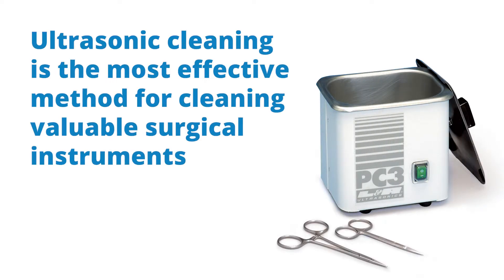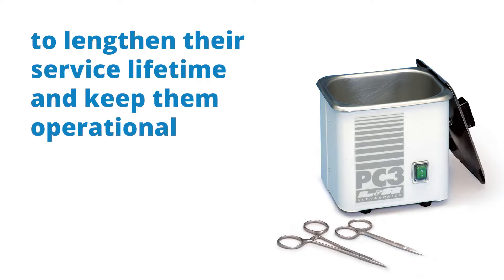Ultrasonic cleaning is the most effective method for cleaning valuable surgical instruments to lengthen their service lifetime and to keep them operational.